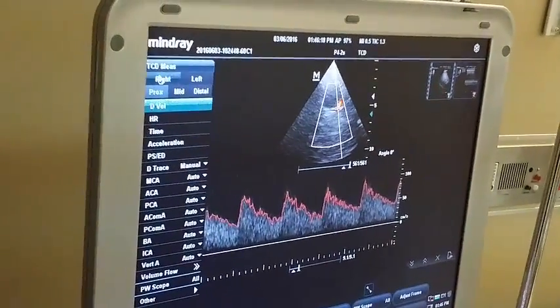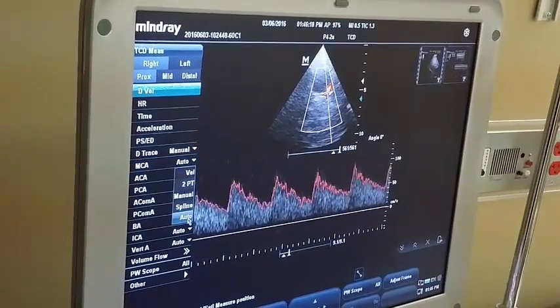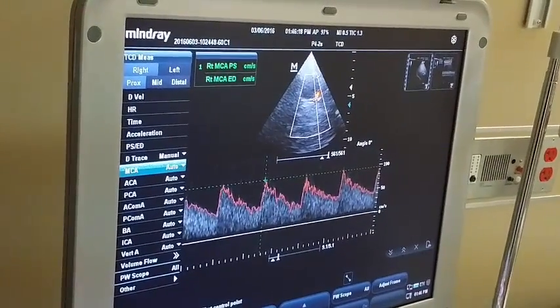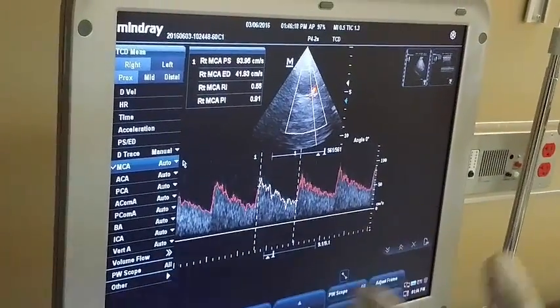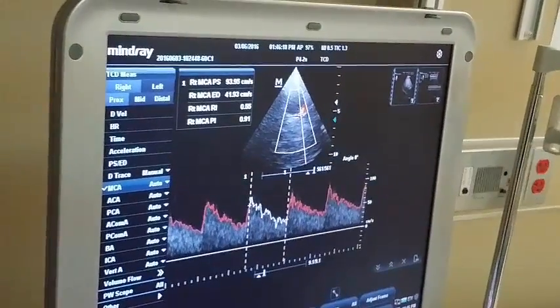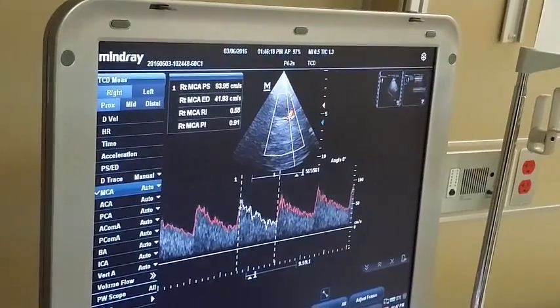I will put the measurement — I will choose right side, middle cerebral artery, auto. I will put it on the peak systolic velocity and on the end diastolic velocity. The machine will measure the PI for you: 0.9, which is normal — less than 1. This is the normal study for the patient.